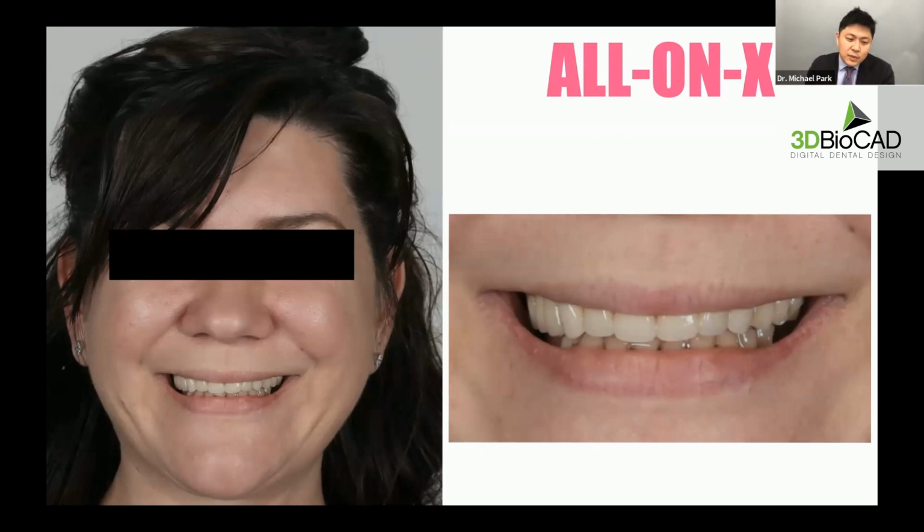The reason is with dentures, we can have the teeth far out forward because there's a denture flange, but with the fixed restoration, there's no flange, right? So we cannot have the teeth too far out because there's going to be lots of undercut here where the food will trap. So we might want to bring that in. In cases like this, I like to do another wax up and make a prototype of the final restoration and try that inside the patient's mouth.